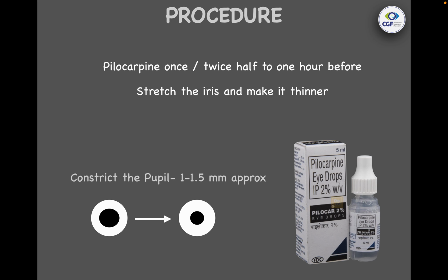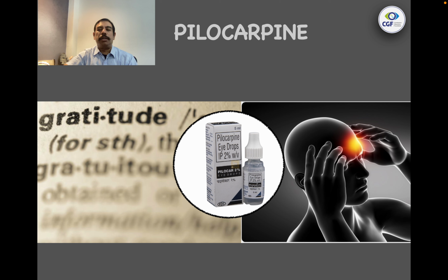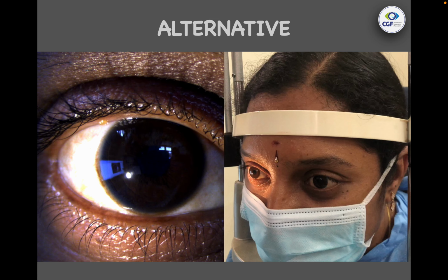But unfortunately, pilocarpine availability is one issue. The second issue is headache, when the patient has a headache post pilocarpine application. So I'll show you a small trick.